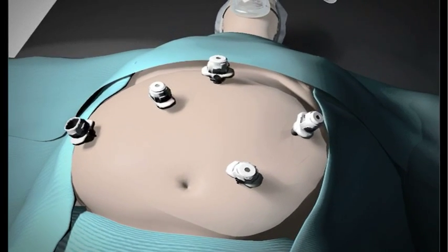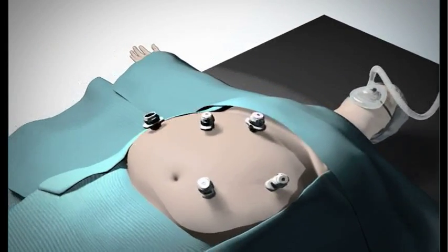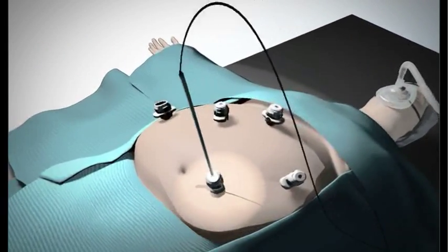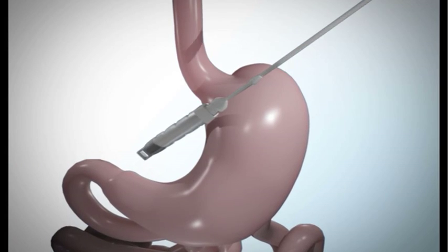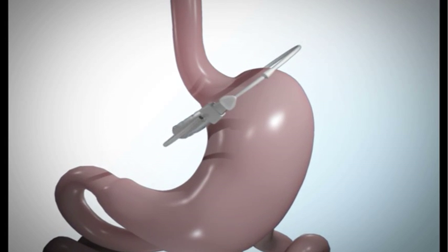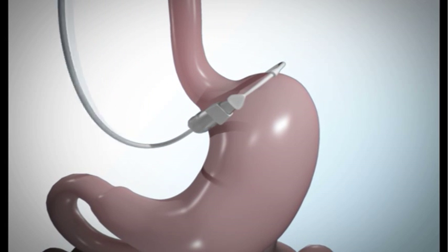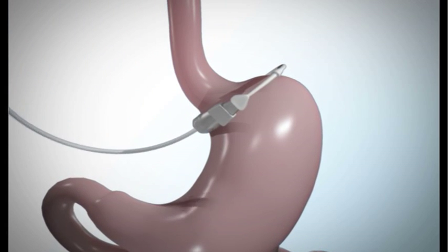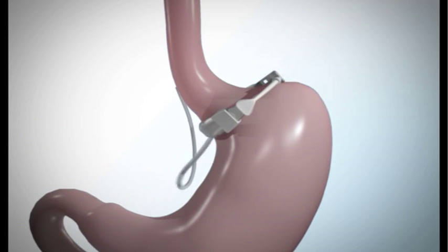Your surgeon will place the adjustable gastric band into the body through a cannula, which is a hollow tube inserted in your abdomen during surgery. Once inside the abdominal cavity, your surgeon will pass the band behind the back of the stomach, near the top area where the esophagus connects to the stomach. This part of the stomach is known as the gastric pouch and has the capacity to hold one to two ounces of food.